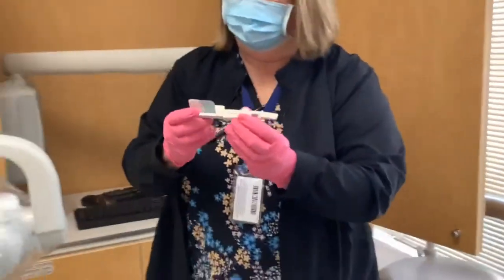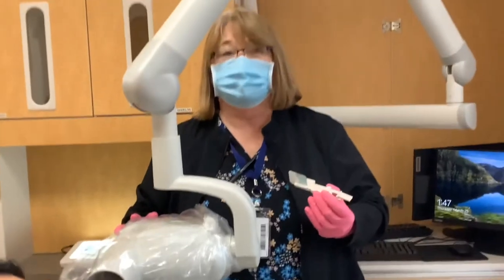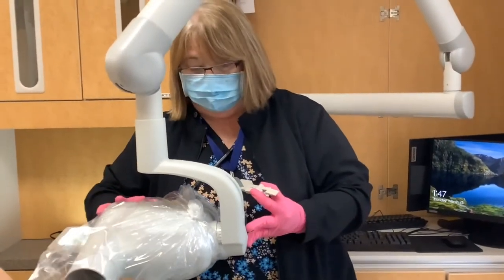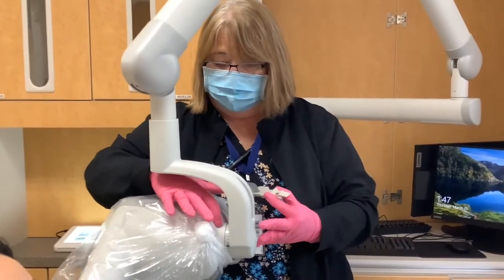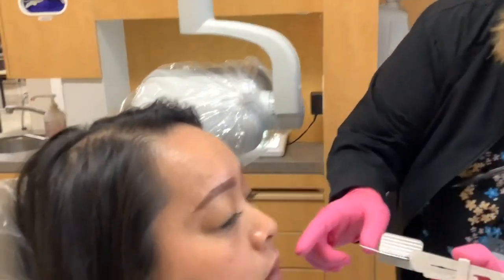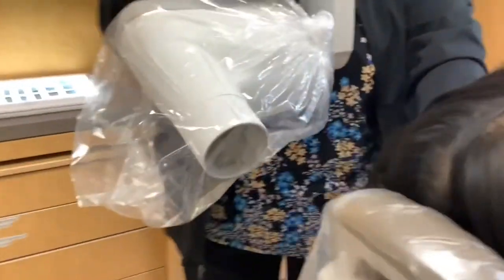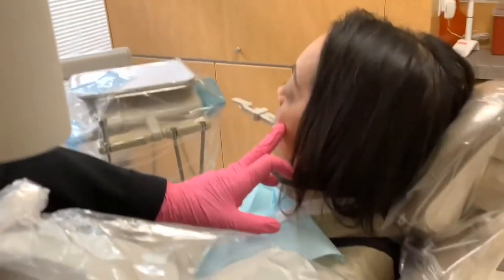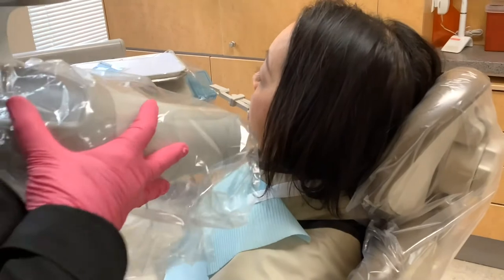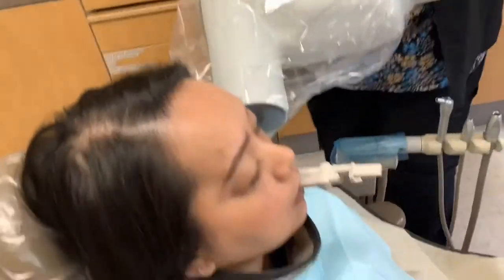I'm going with my molar shot. My positioning for the molar shot is at plus 20 — what's our song? 20, 30, 45, 40. So we'll go to 20. Using the line of the x-ray head with my 20-degree angle, I'm going to position my film over the molars and have the patient bite together. That is covering my molars — the second molar in my patient's mouth is right about here. I'm taking that degree of 20, finding my molar.